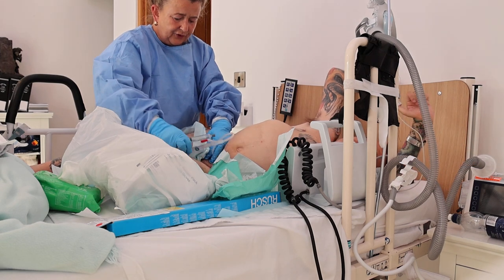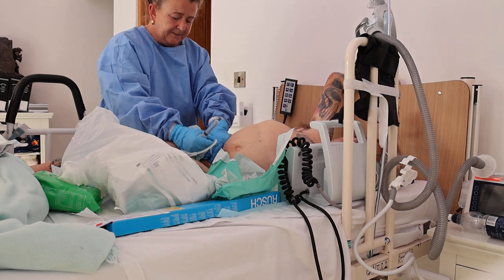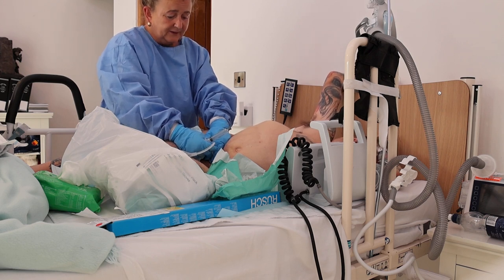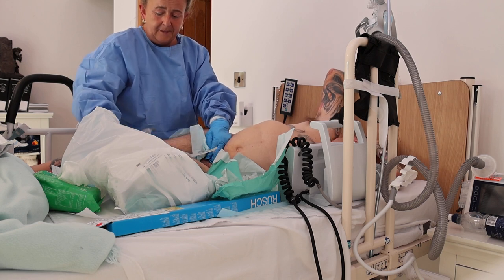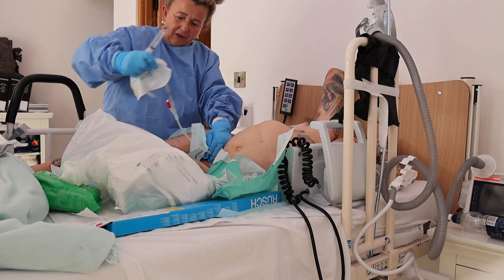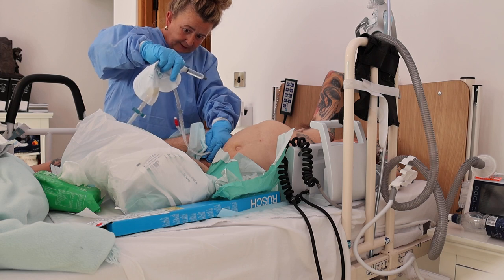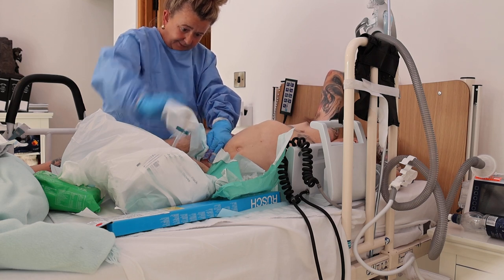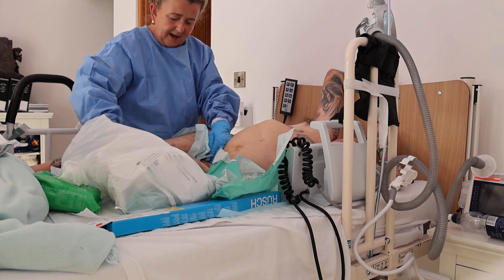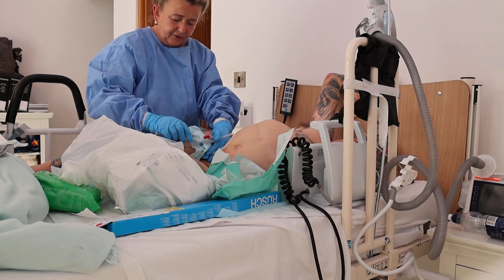Okay. Already, I've got that many sediments out. And it's in place. And I'll tell you how to feel it's in place. You can just get that resistance, that tiny bit of resistance. Have you already blown it up then? No, just about so. I won't blow the balloon until I know I've got perfect urine flow. I haven't just got urine. I've got actually black bits. I'm going to try and show the camera this. Look. So, yes, I've got a flow. I've got about 50 mils of urine. I'm happy. Are you happy? I'm happy to take the cap off. And I'm happy to turn it round. Press.